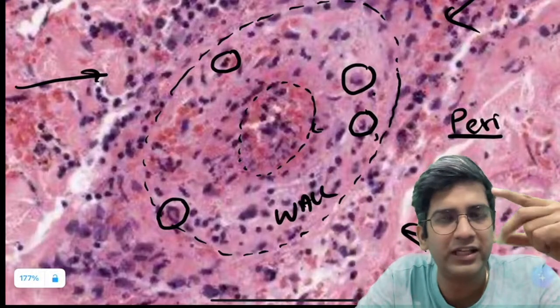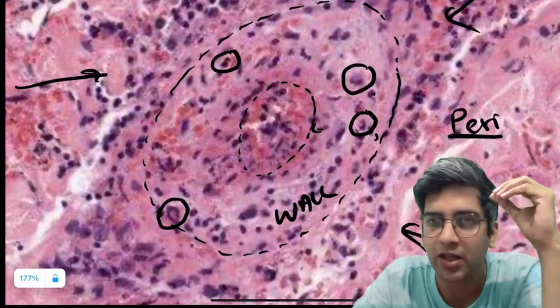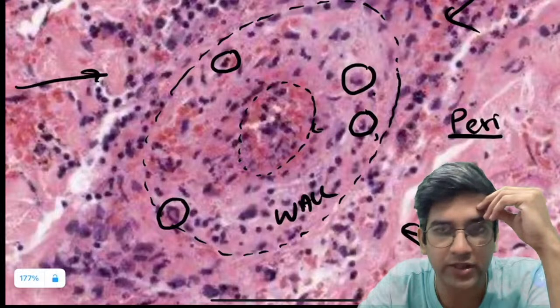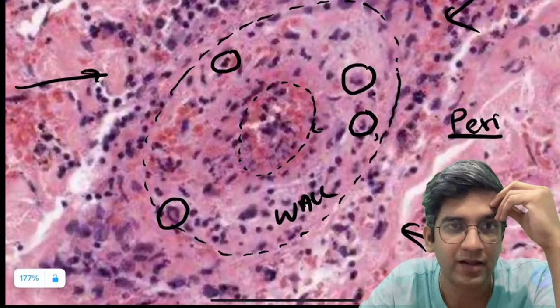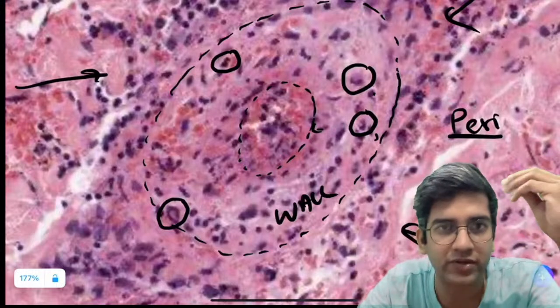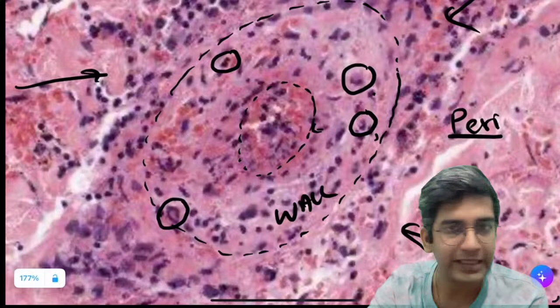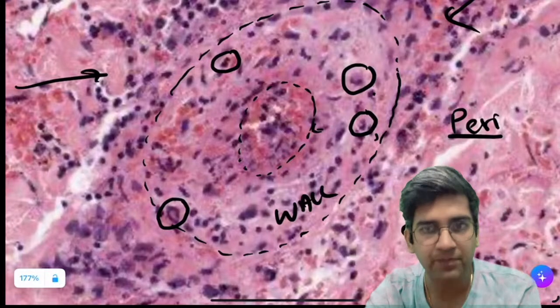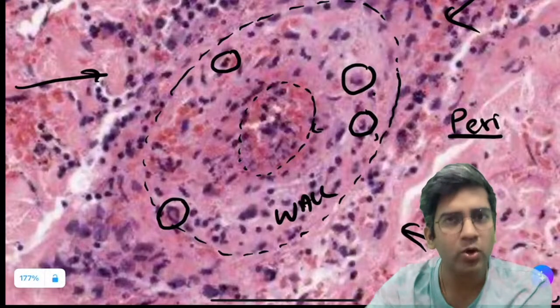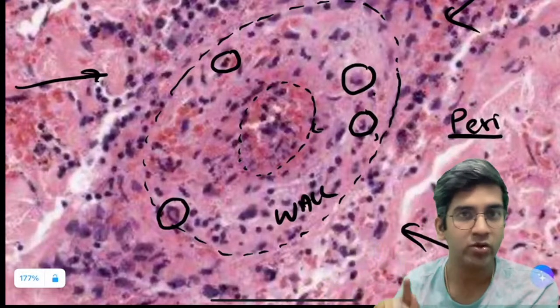I have neutrophil, lymphocyte, macrophages, since it's tissue, eosinophils. Okay, Hakim and Hema are going for neutrophils. Eosinophils, Juhi. Sitara, neutrophils. Junu, neutrophil. Okay. Junu, did you call it an eosinophil because you're seeing bilobes? If that is the reason you call it an eosinophil, with respect to a biopsy, a neutrophil also will look like bent nuclei only. It will not have the lobations. Fine. Remember that alone forever, right?